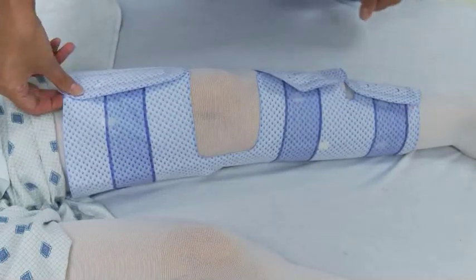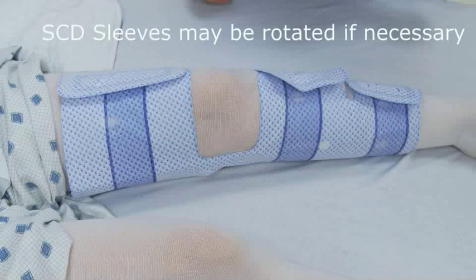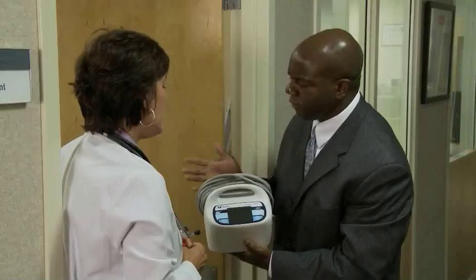For proper application, two fingers should fit between the sleeve and leg. Correct fit should be routinely assessed. Do not position the sleeve such that the tubing can form pressure points on the patient's limb. This may be particularly important in certain prone, kneeling, or side-lying positions. In these cases, the Kendall SCD sleeves can be rotated around the limb with no reduction in efficacy.